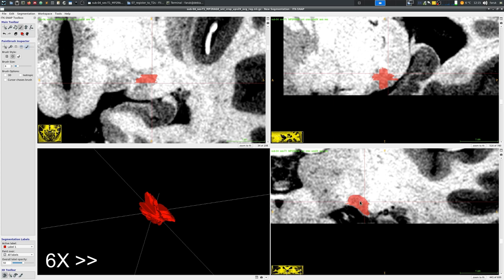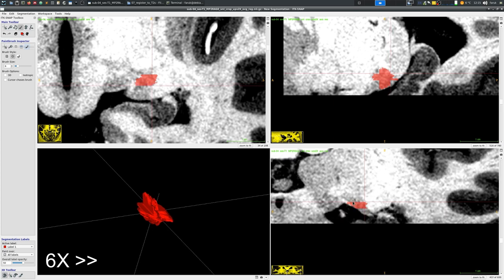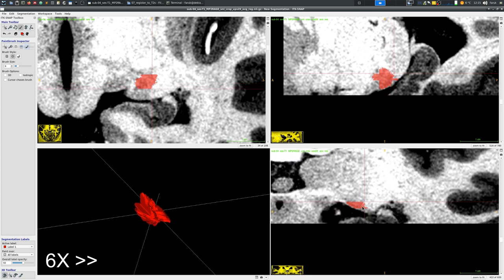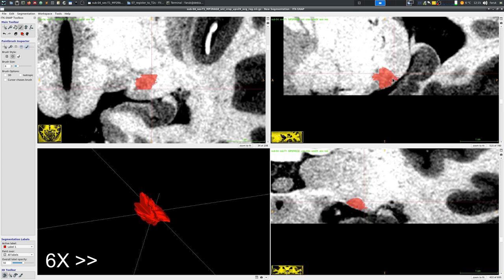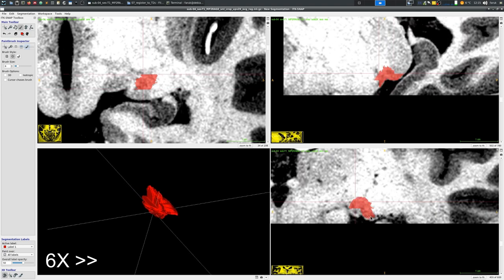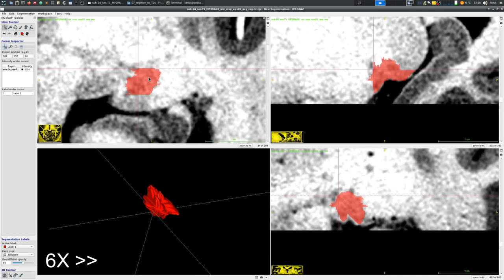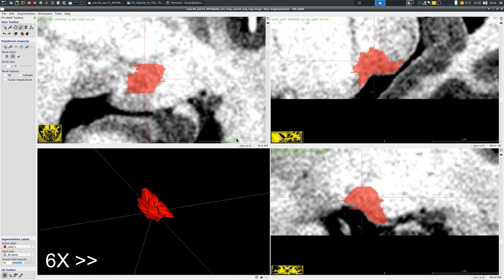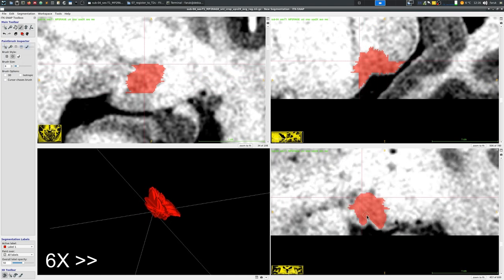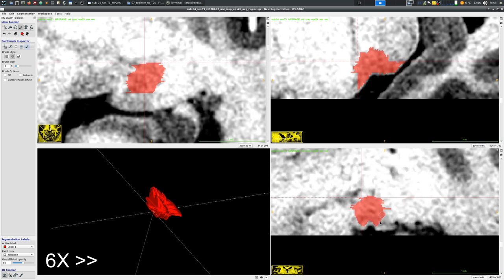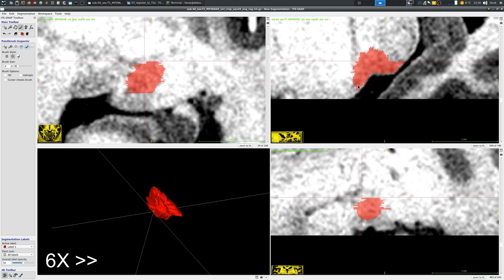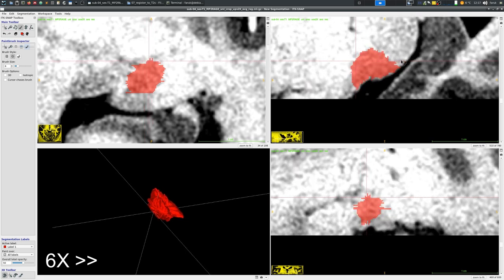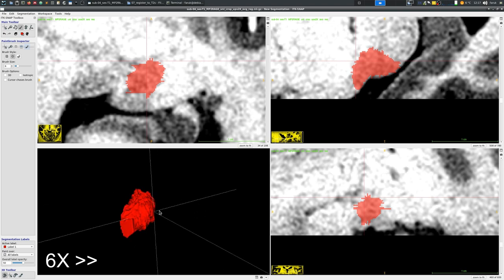It is important to sometimes switch the perspective that you are looking at the brain to be able to see more easily the contrast between different tissues around LGN or the borders of LGN. You can see that sometimes I am using the coronal view, sometimes I'm using the transversal view or sagittal view to basically cover as much area as possible.